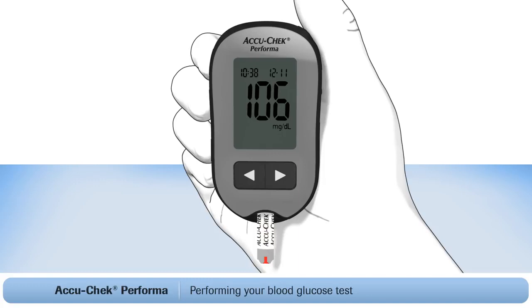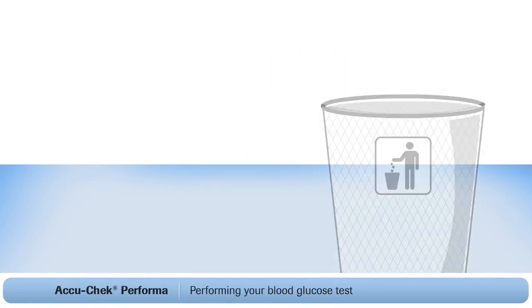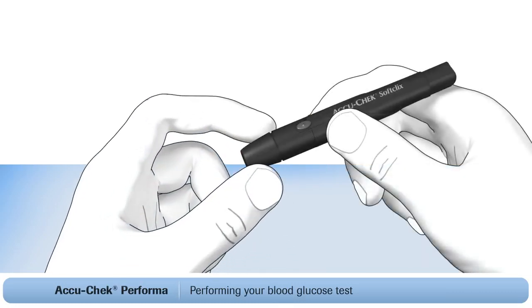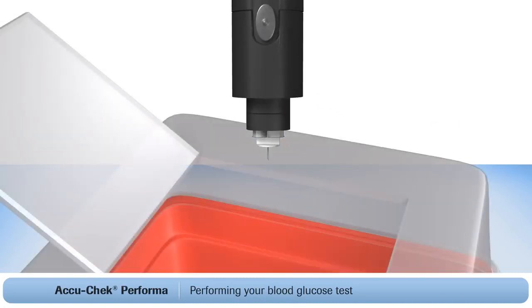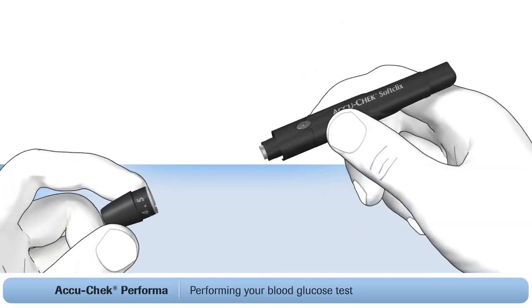Two important final steps. First, dispose of the used test strip. Then, dispose of the used lancet. Always dispose of used lancets so they cannot cause injury. Use a sharps container. Remove the cap. Then, point the lancing device into the container and eject the lancet by sliding the ejector forward, as shown. Then place the cap back on the lancing device.